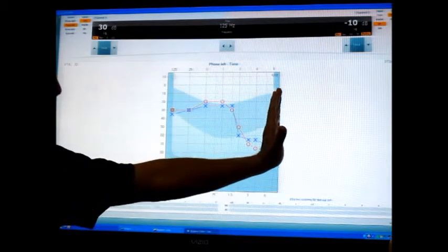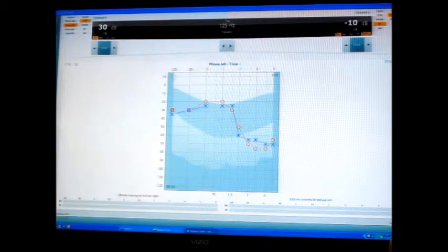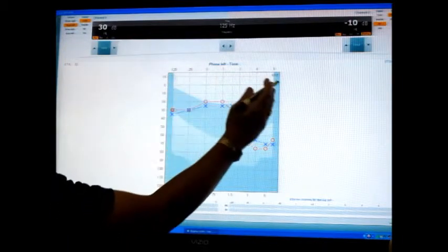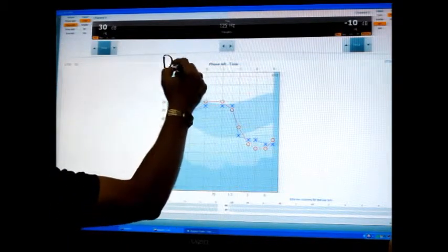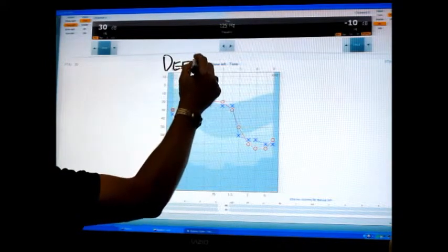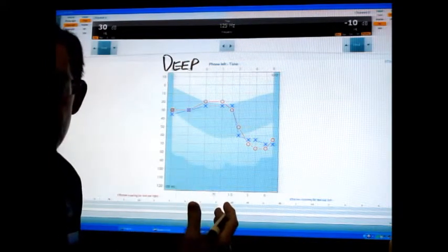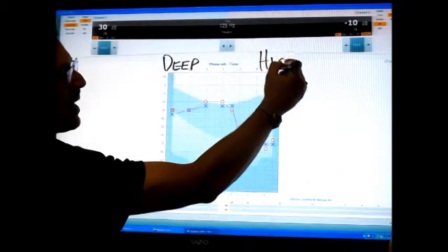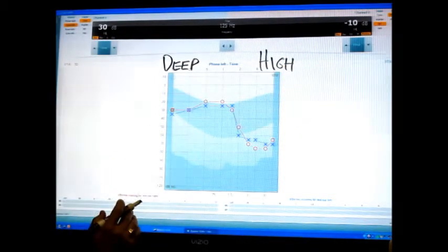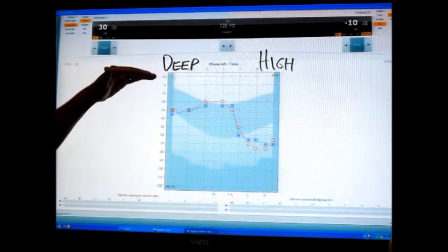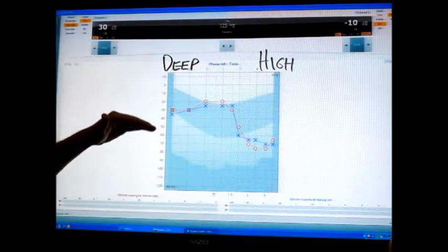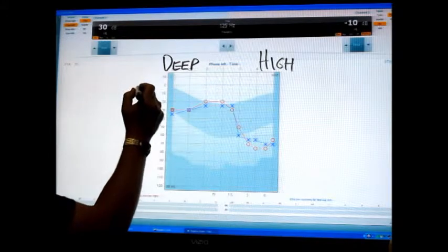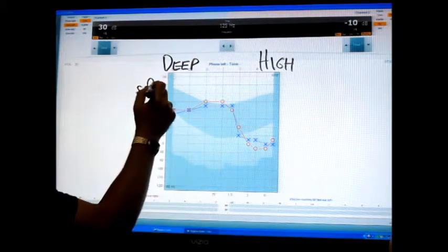The way this chart is tracking your hearing, going from left to right we're moving from deep tones here at the left, kind of like a piano keyboard, and on the right hand side we have higher pitched tones. Now the vertical lines are measuring our volume.